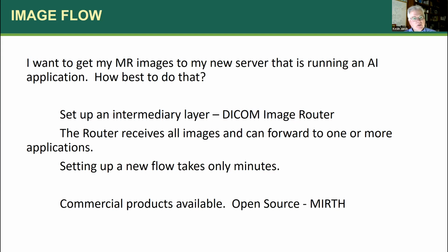There's also open source software I've used in the past, a software package called Mirth. There have been occasionally in the past live lab sessions at RSNA talking about this software, and it basically can be configured like a DICOM image router and also handle HL7 messages. Very powerful little open source software package that's pretty handy.